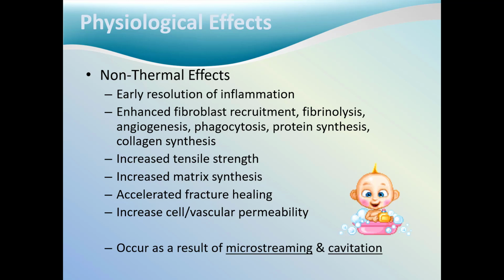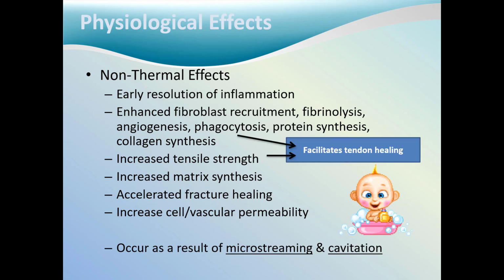Again, the non-thermal effects of ultrasound include early resolution of inflammation, enhanced fibroblast recruitment, fibrinolysis, angiogenesis, phagocytosis, protein synthesis, collagen synthesis, which helps to facilitate tendon healing, increased tensile strength, which also helps to facilitate tendon healing, increased matrix synthesis, accelerated fracture healing, and increases in cellular and vascular permeability. These non-thermal physiological effects occur as a result of microstreaming and cavitation.